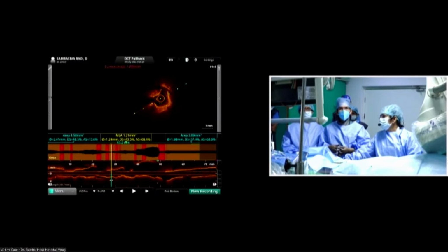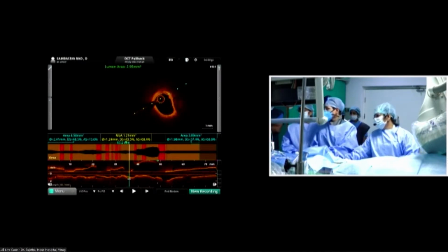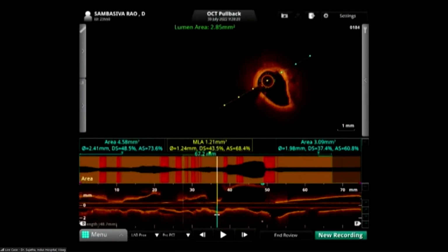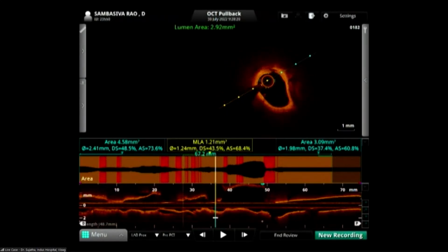And there's definitely a huge amount of calcium. Yes, the score is 4, sir. We measured, so are we going to stent, or do we need any further preparation strategy? Here at 3 o'clock, there is definitely a calcified nodule as well. That is a thick calcified nodule, and the score is 4.